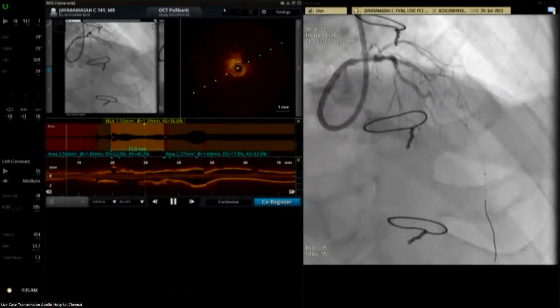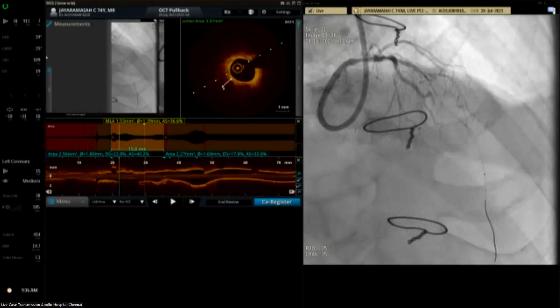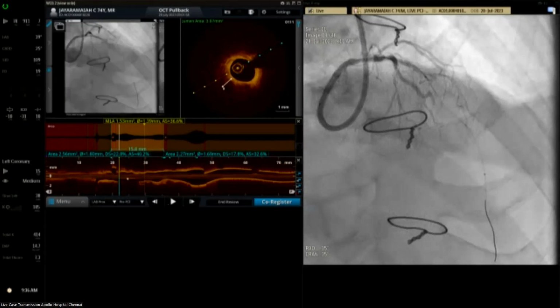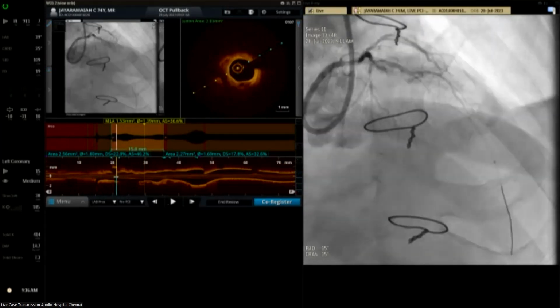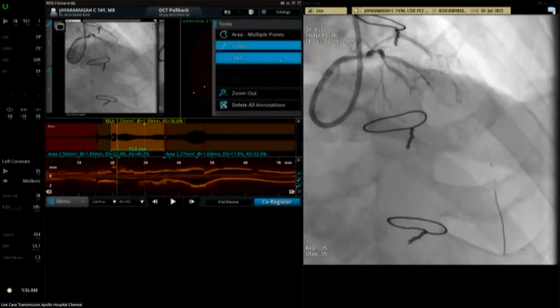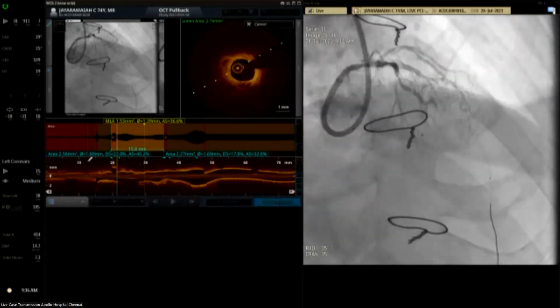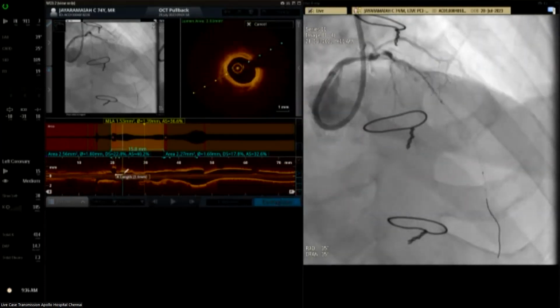I guess what is the opinion from the... Refai, actually, we wanted to know what is the thickness of the calcium, whatever you have seen. The thickness of the calcium is definitely more than 500 microns in some segments. And the length is definitely more than 5 millimeter in certain parts of the calcium. You can see there. And the arc is not 360 except for one focal spot. So the calcium score, if you're interested, is around 2.